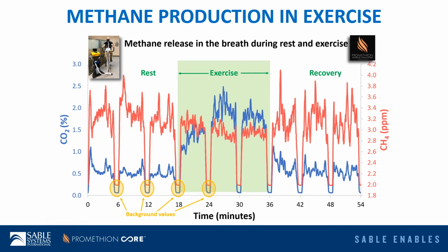In this trial, we switched from measuring the exhaled breath to measuring the background methane or ambient methane levels and back to the breath every 6 minutes. Now, during the first 18 minutes, his exhaled CO2 and methane levels remained fairly constant. You would have expected this.